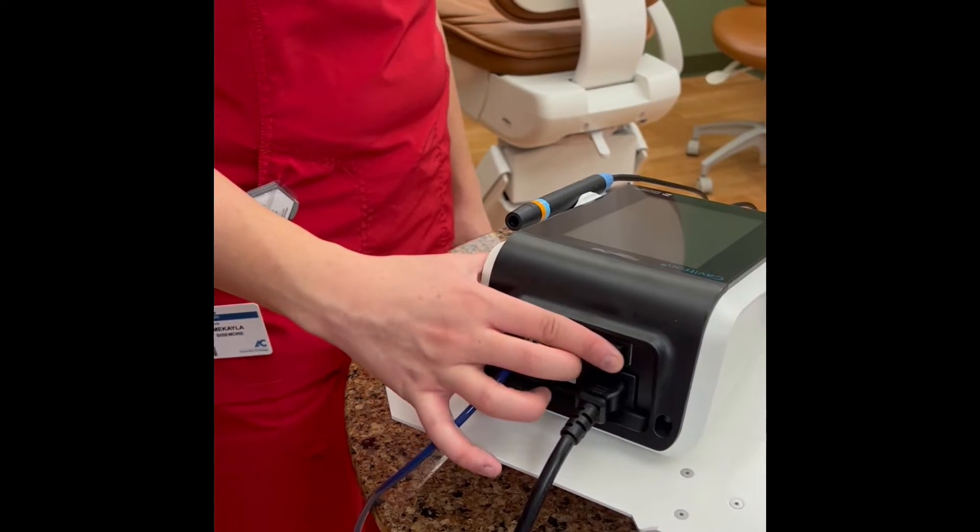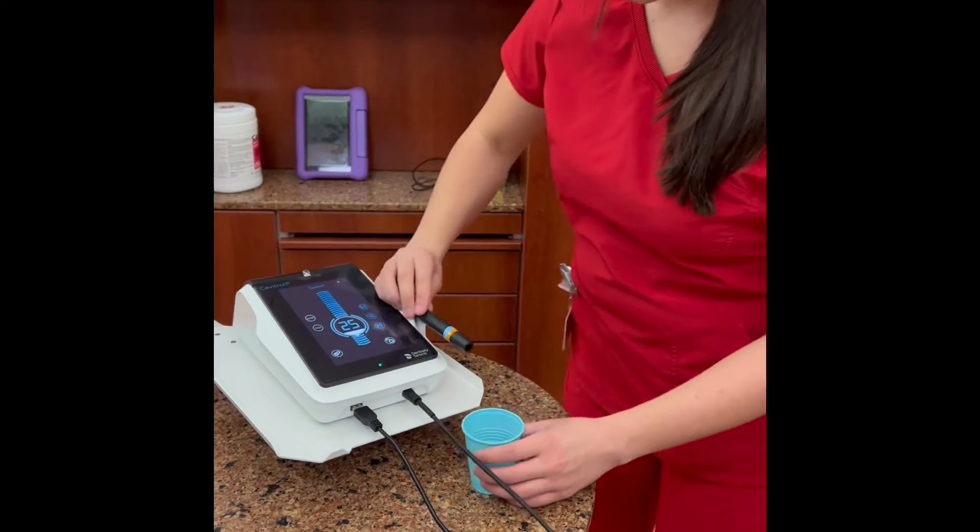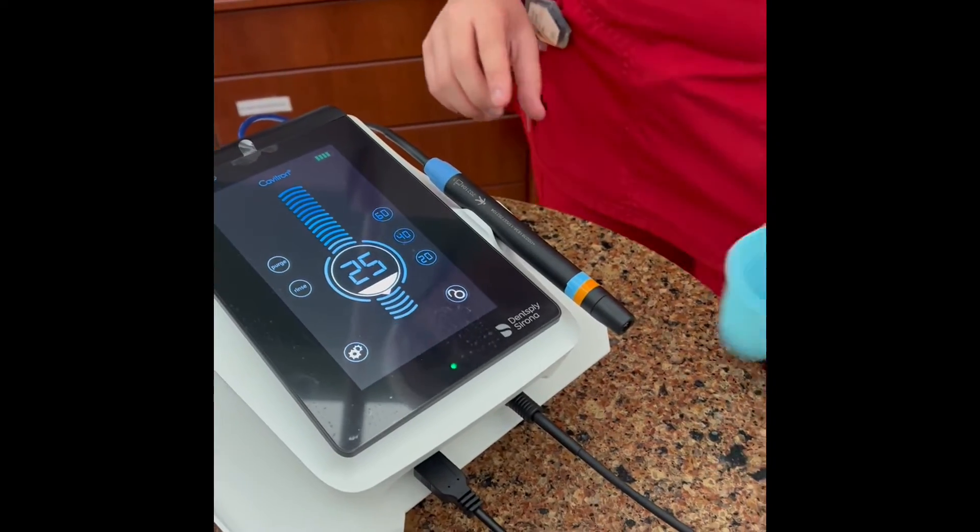Turn on the master switch. Switch on the Cavitron using the button on the back. Purge the device for two minutes by either holding it over the sink or a cup.